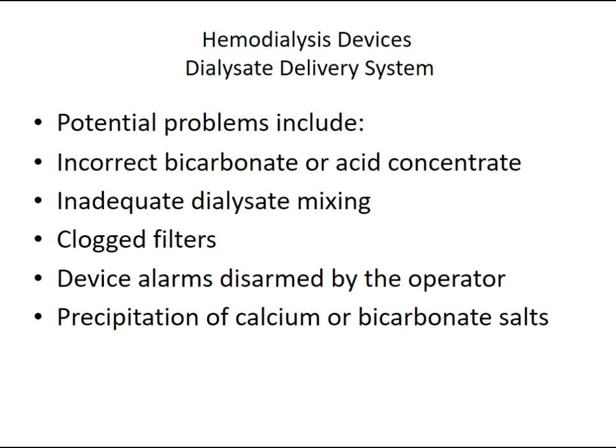Potential problems in the hemodialysis dialysate delivery system could harm the patient, including incorrect bicarbonate or acid concentrate, changing the pH of the fluids, inadequate dialysate mixing, clogging in the filters, device alarms disarmed by the operator, and precipitation of calcium or bicarbonate salt inside the hemodialysis machine.